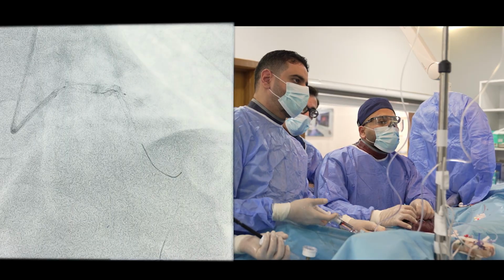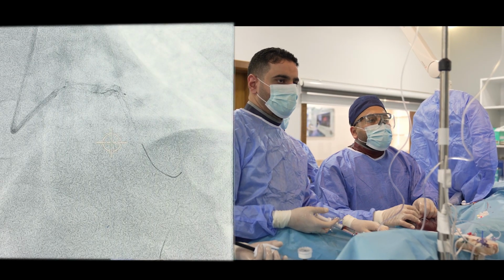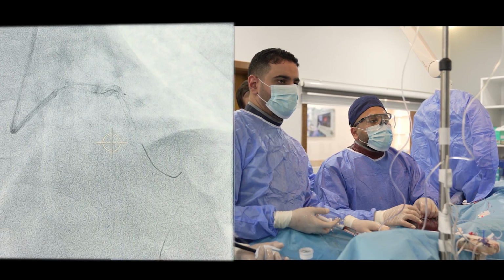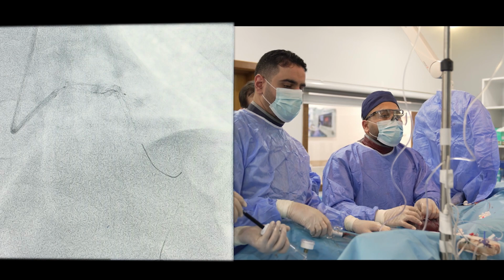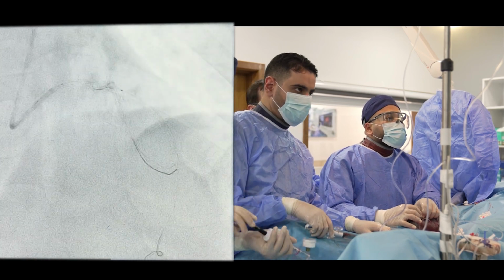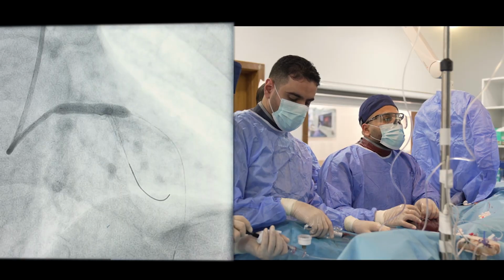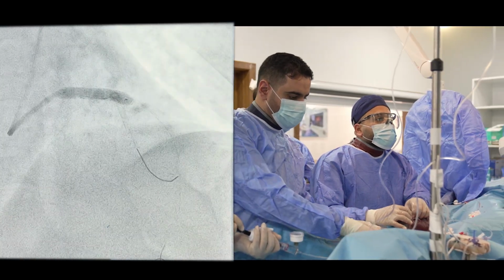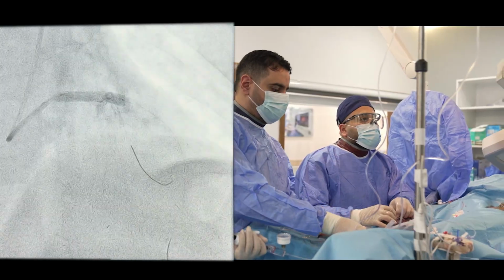Let it have some rest. The pressure is recovering. Okay. Go 14. 14. 5.15. Off.